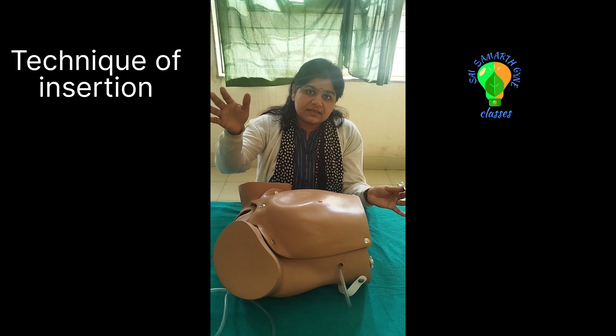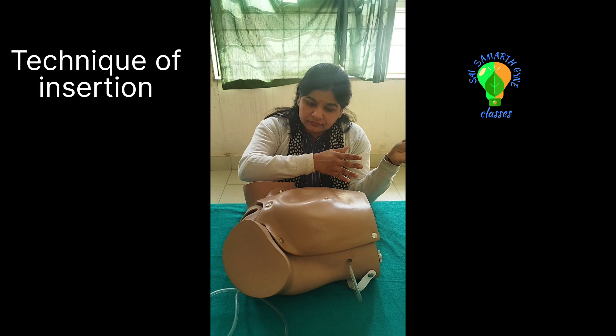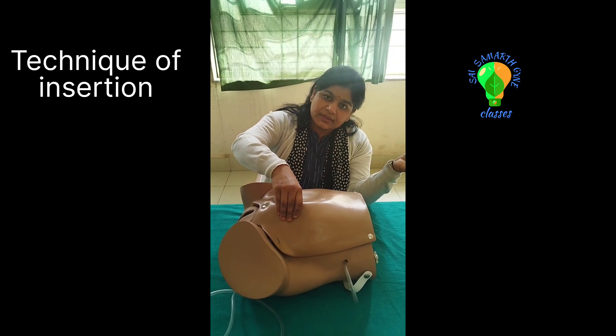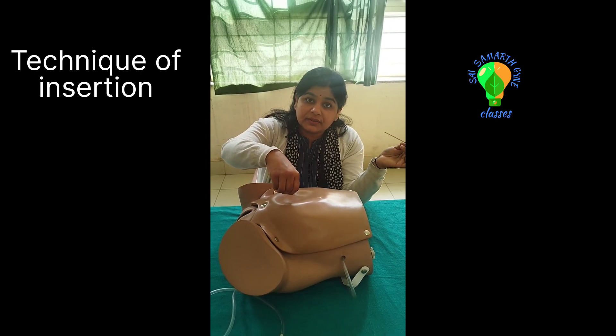The patient is in 15 degree Trendelenburg — head down — so the bowels have moved up. The assistant is holding the fold of the skin and lifting it up, creating a space inside the peritoneal cavity for safety purposes.